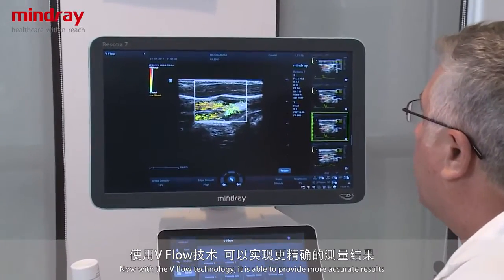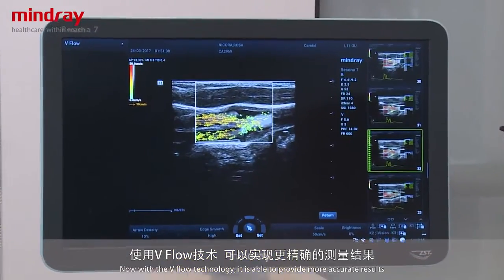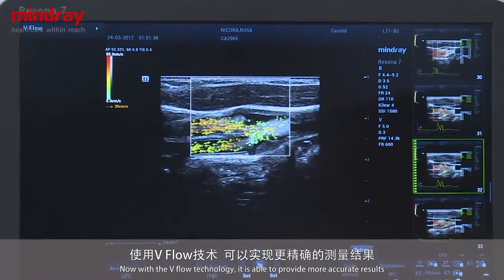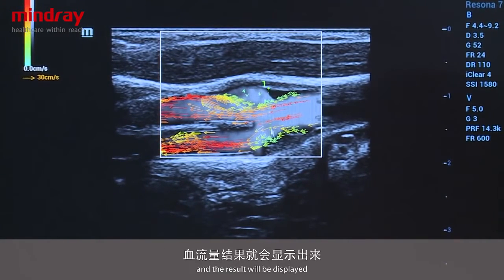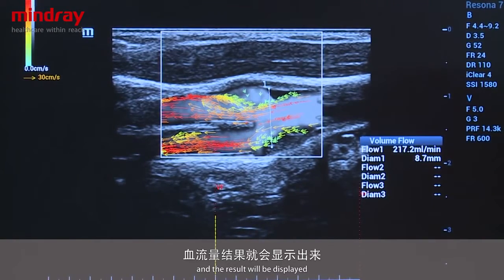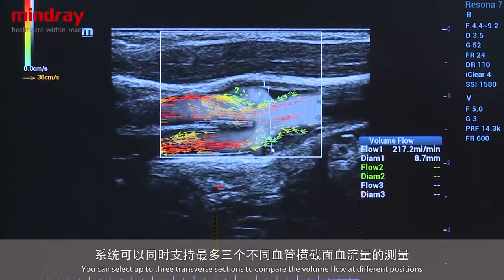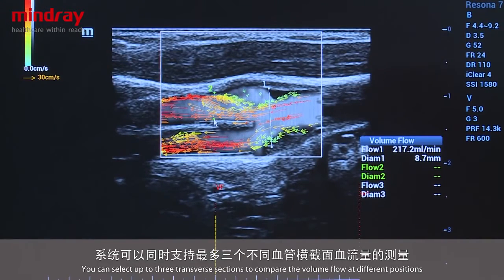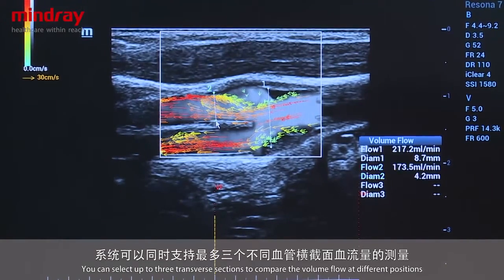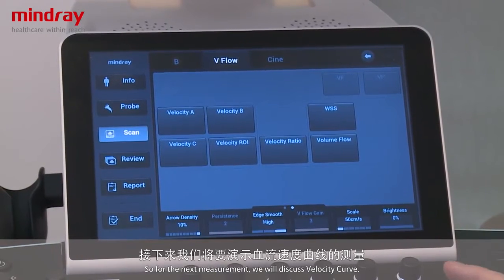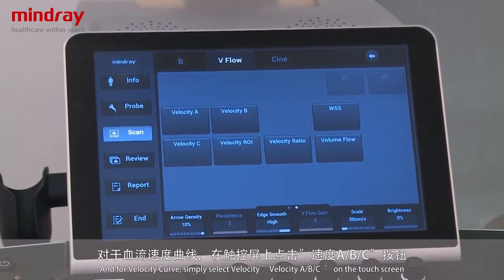In traditional ultrasound platforms, volume flow is typically measured by pulsed Doppler, but with V-flow technology it provides more accurate results. Simply define a transverse section on the vessel and press select. The result will be displayed, and you can measure up to three positions to compare volume flow at different locations.